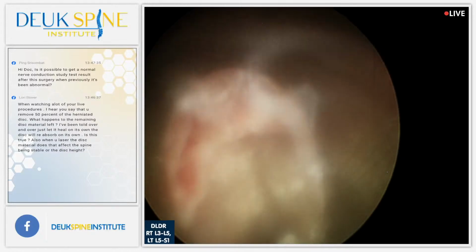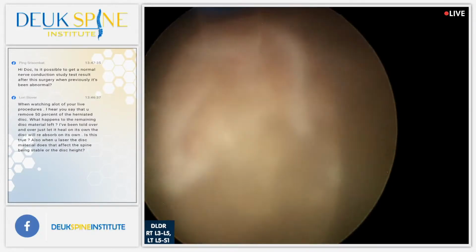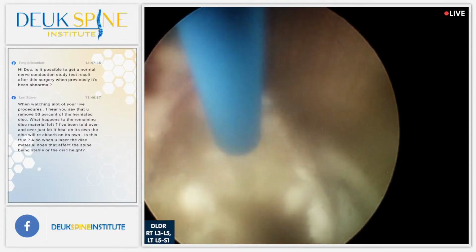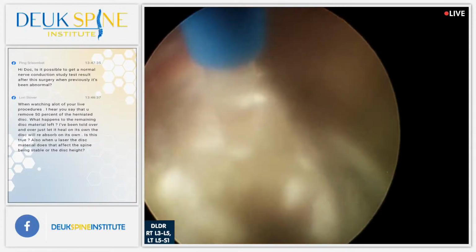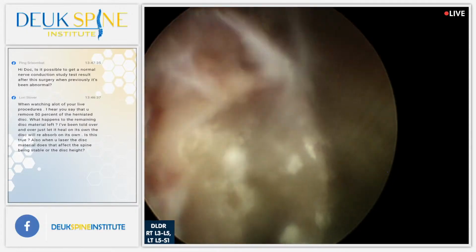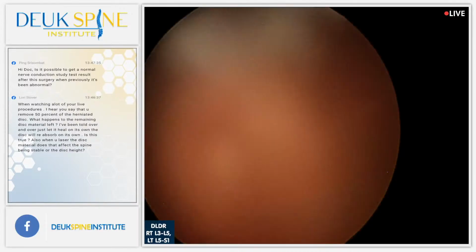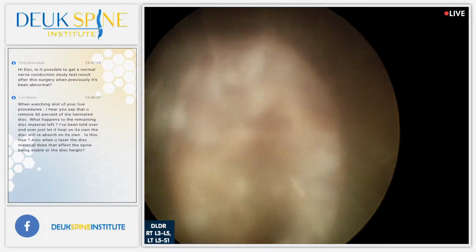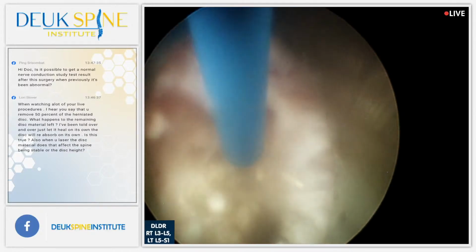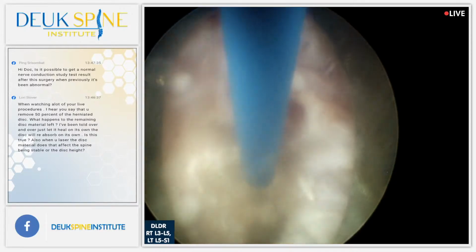Now, the other 50% is the 50% that's not doing anything to cause symptoms. And that's usually the part that's in the epidural space. Okay, we're removing the part in the lateral recess and the part in the neural foramen, but we leave the part in the epidural space because number one, we can't reach it, but more important than that, it doesn't cause symptoms. It just stays there and it gets scarred in and doesn't do anything.